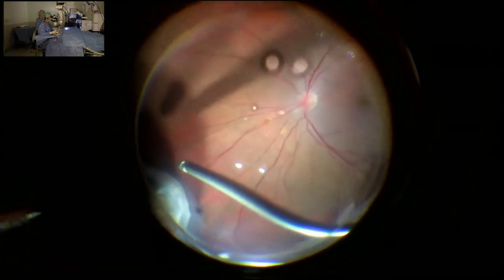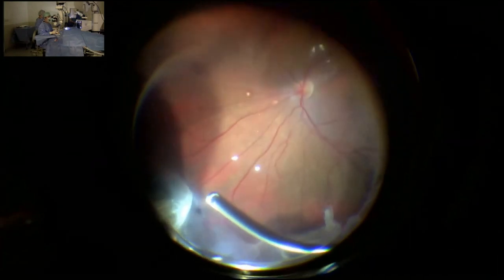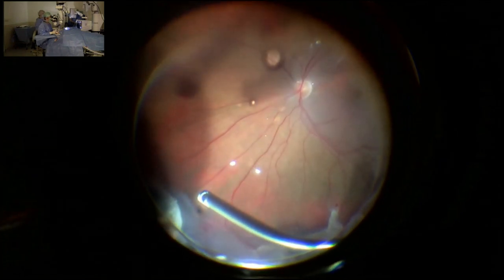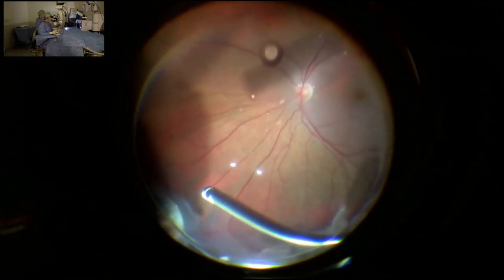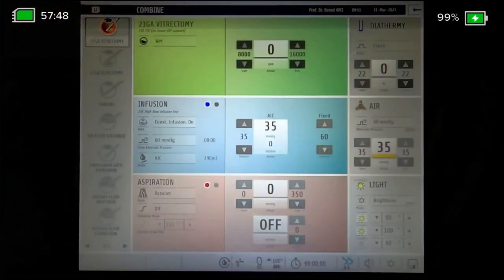Professor, do you hear us? Yes. Could you tell us about the shave regime? What cut rate and aspiration? The cut rate is the maximum. Usually I use the TDC cutter at 8,000 cut rate. The aspiration is about 300 millimeters of mercury.